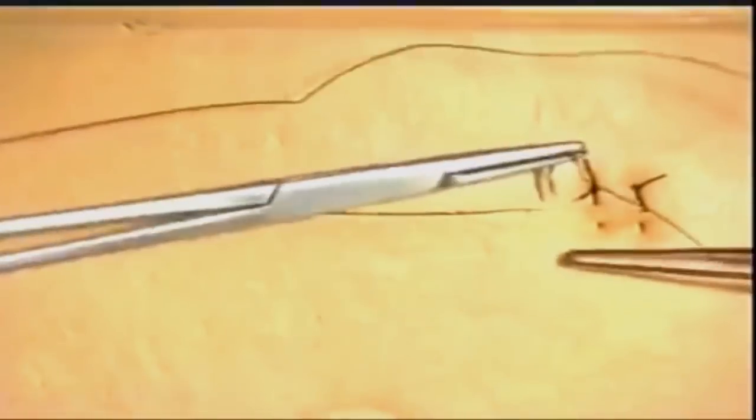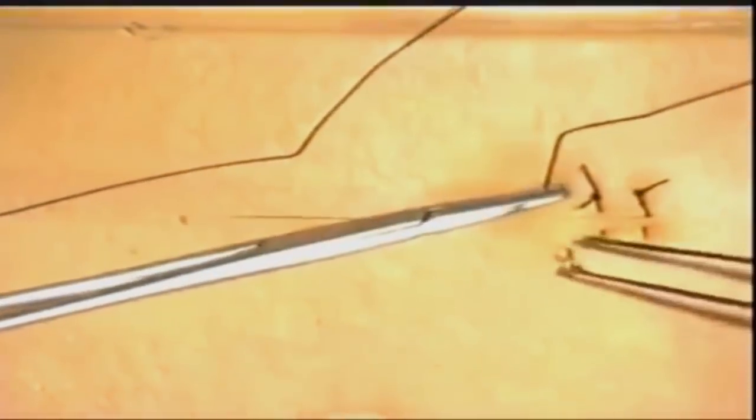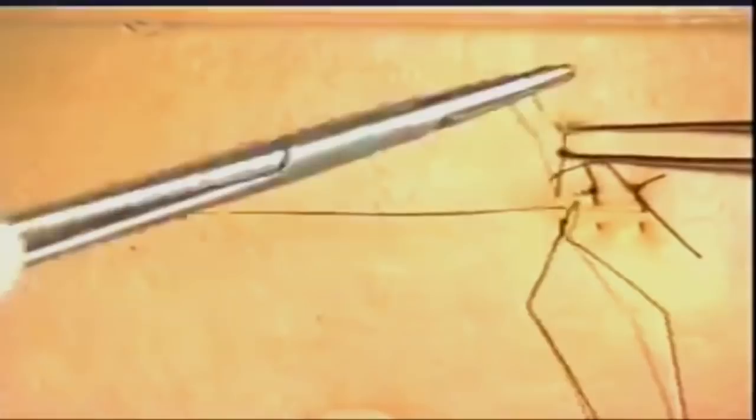Let's insert just one more vertical mattress suture at right angles. Reverse the needle and then go back, just taking the wound edges as seen.